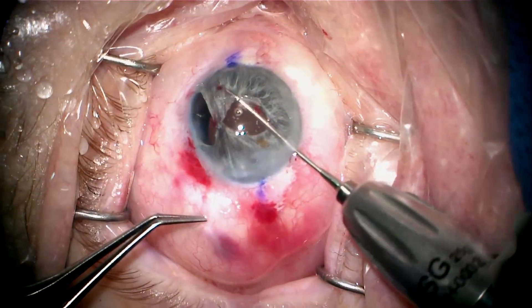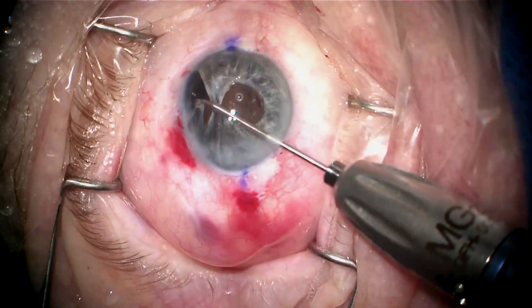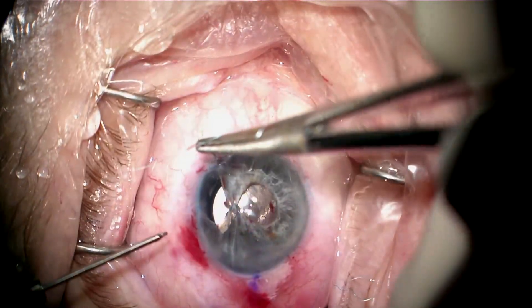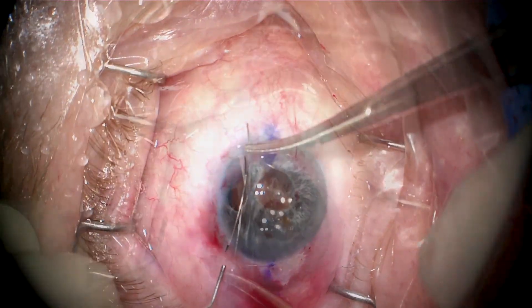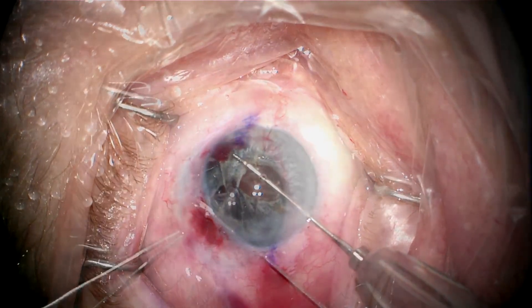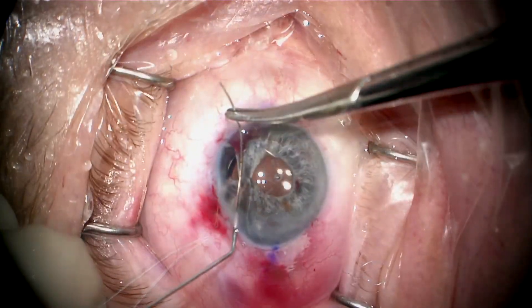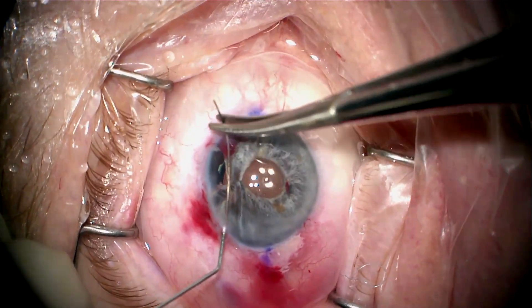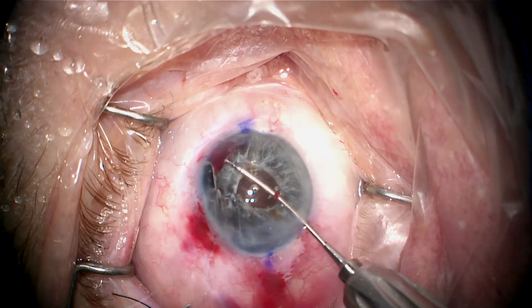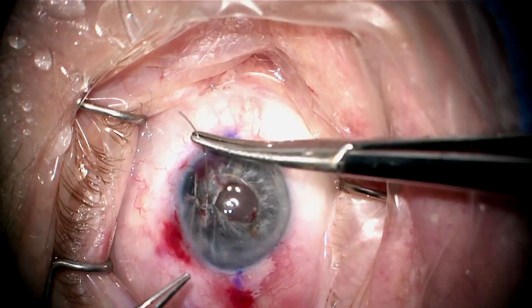This is under a lot of tension right here, so now I tie and cut this — I've recreated my pupil. Now I want to see if I have enough tissue to close this defect as much as possible superiorly. I'm going to pass the suture through one side of the defect and then the edge of the cut flap, and try to bring that together. I'm passing a second suture to close it further. This tissue is very thin and atrophic, so I have to be really careful not to cheese-wire. You can see the bleeding from the root of the iris up top.